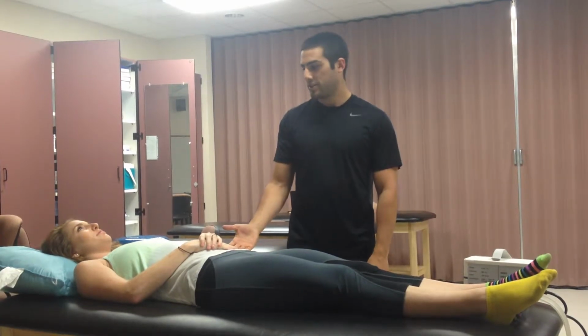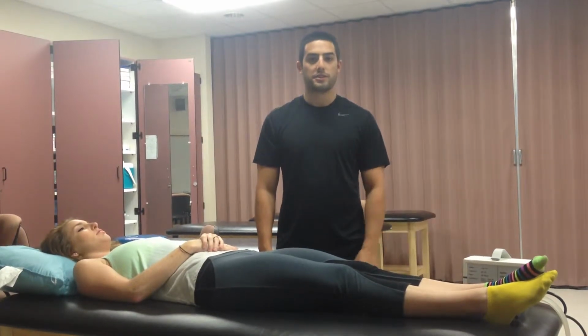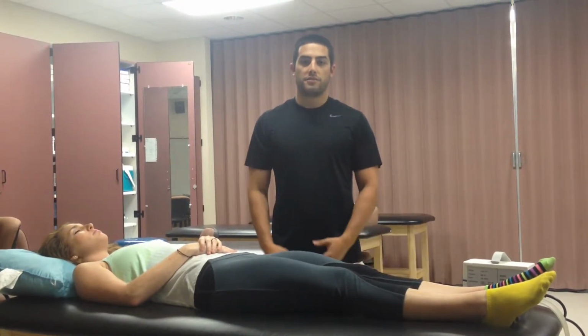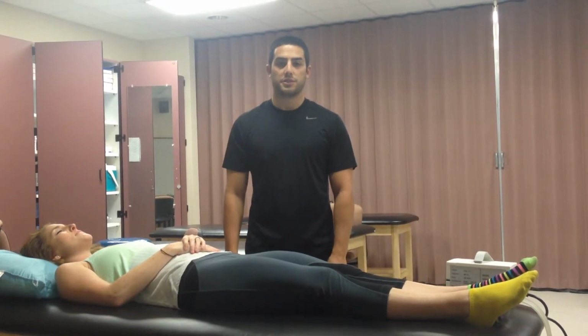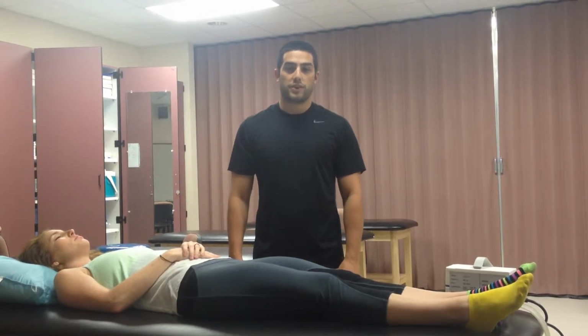Here we have a patient who's a 70-year-old female following a recent surgery and is now bedridden. We're going to apply intermittent compression to her lower leg to help prevent deep vein thrombosis. Some other benefits of intermittent compression can include edema control, treatment of venous stasis ulcers, residual limb shaping after an amputation, and control of hypertrophic scarring.